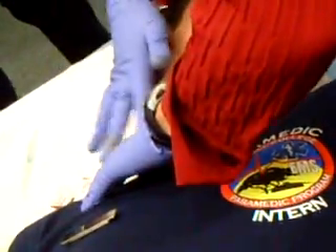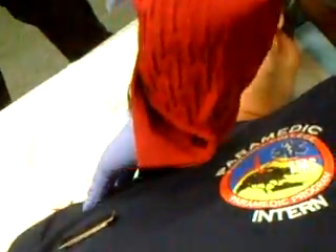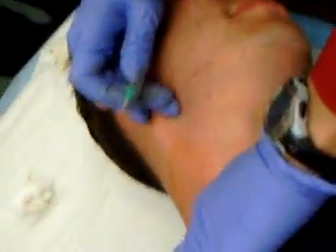Oh, there it is. Grab his legs some more. Now it's really — there you go. I got it, now it's popping. Okay. Are you ready? One second, I need to get my video camera. Okay. So I want to hold traction.